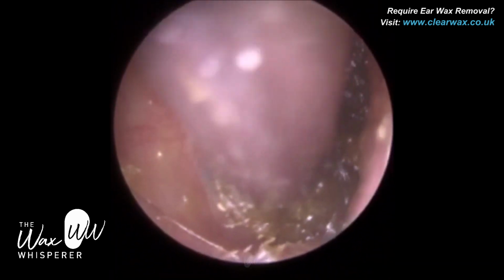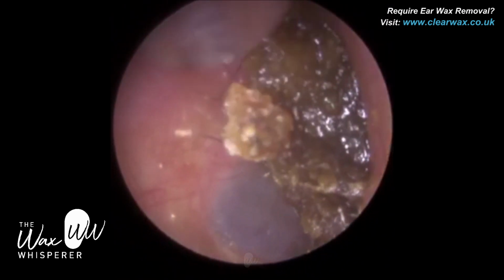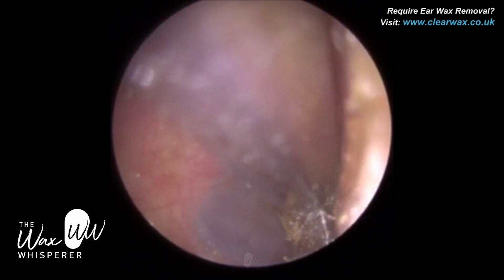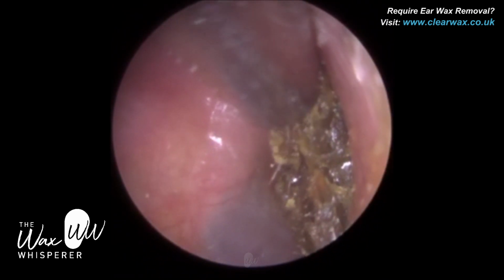We've got this remaining residual plug of wax. It's quite sticky. I was contemplating putting some olive oil earwax drops at this stage just to loosen this, but again, I'm referring back to that kinesthetic feel. I just felt doing the procedure that this was going to come out if I'm gentle, and again, I've just got to avoid that anterior canal wall. This is the anterior recess.